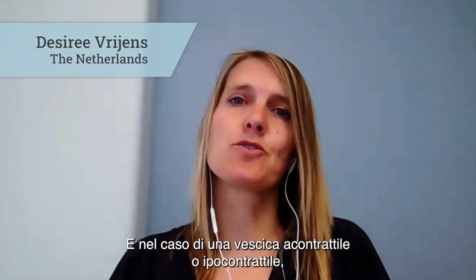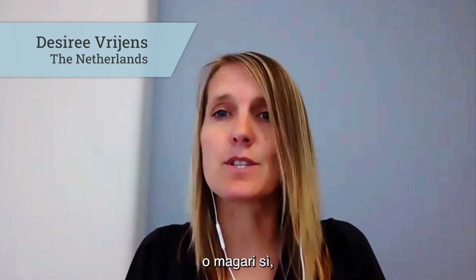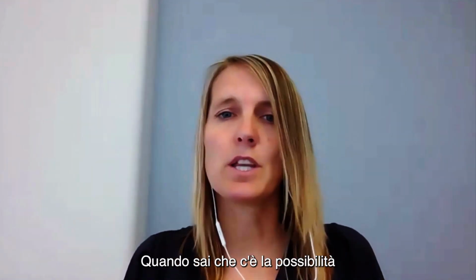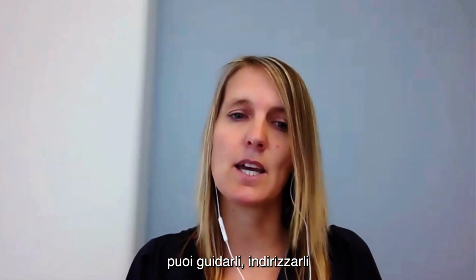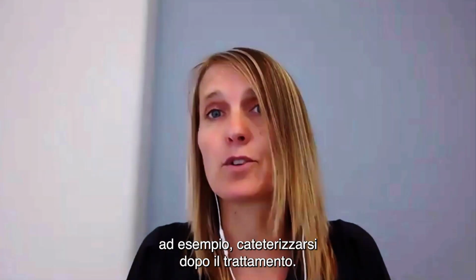So the information that we get from the urodynamic studies is of utmost importance when we counsel our patients on the available treatment options. And when there is an acontractile or hypocontractile bladder, you might not consider to have a sling as a first choice. Or you might consider it, but you can better inform the patients about what to expect, about the treatment results, about the possibility of complications. When you know that there is a possibility that they won't void properly after putting a sling in, for example, you can guide them, you can explain them and explain that there is a possibility that they have, for example, to catheterize after the treatment.